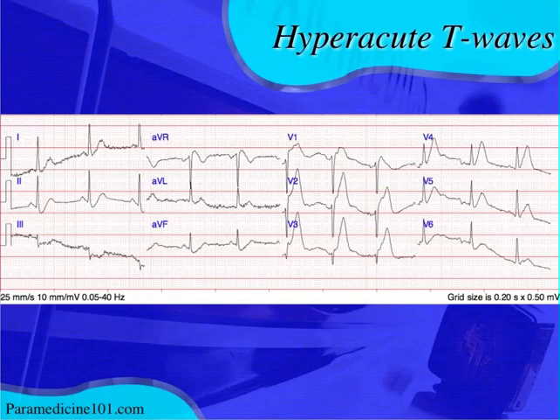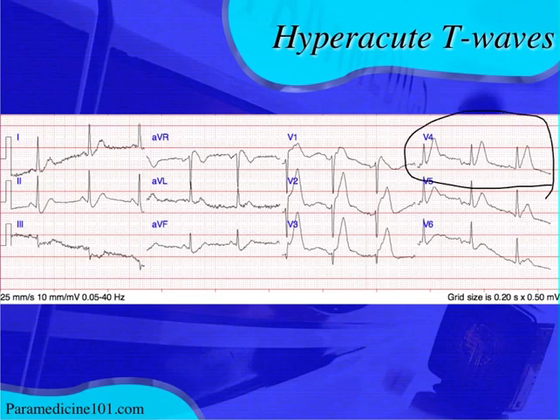Since we're on the topic of T waves, here's an example of a hyper-acute T wave. Even without ST elevation, the key difference between hyperkalemia and hyper-acute T waves is that hyper-acute T waves have a broad base — they're broad-based, symmetrical, and tall. This patient would probably be experiencing chest pain or shortness of breath and fit an MI or ACS type presentation.